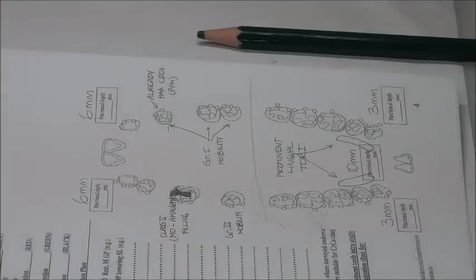If grade 3, extraction. Grade 1, it had previous periodontal disease. I can put my components on it, but it's preferred to change my components into stress-releasing components. Okay?